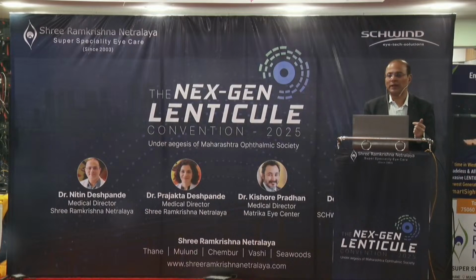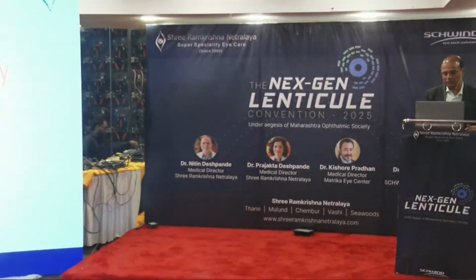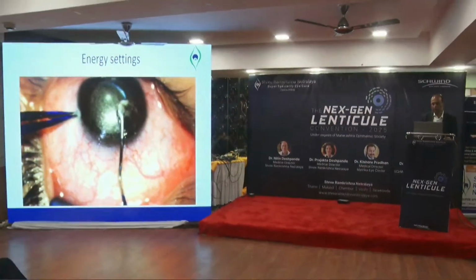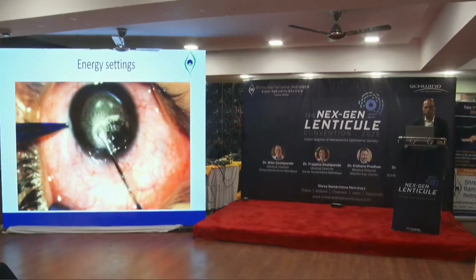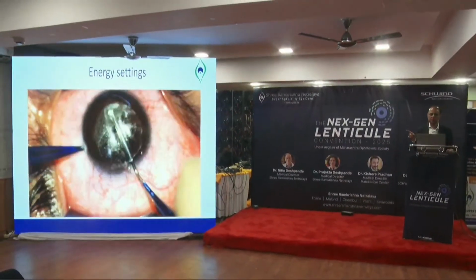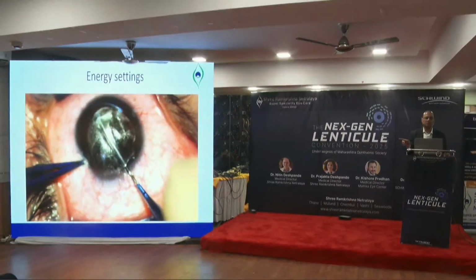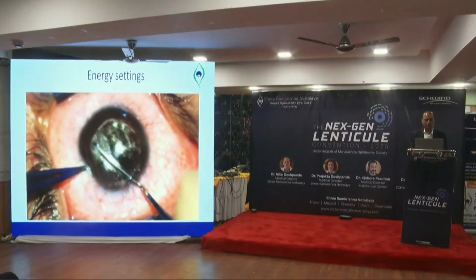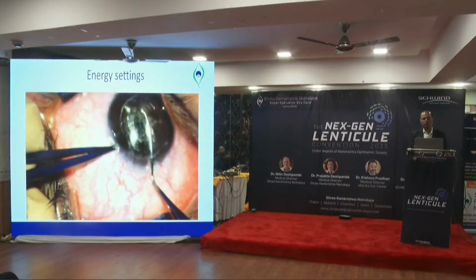As I told you, energy setting is very, very critical, and I'll show you the first session where we found that our laser settings were still not in place. You can see how tough the dissection can be if your laser settings are not proper. You saw my previous video of live surgery where I could just swipe, but here you see the struggle. That is because our energy settings were not yet set in the initial settings. But now once we have it right, we know we can.